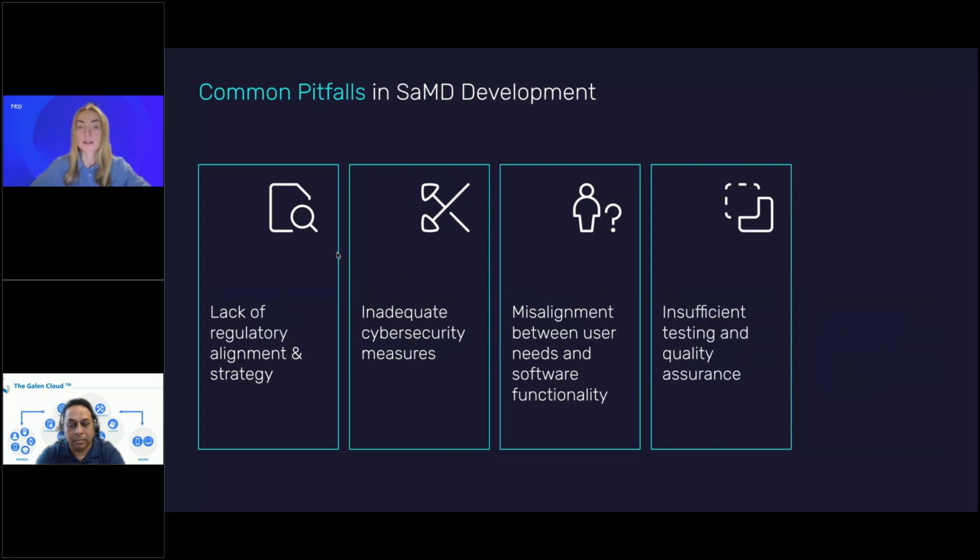Insufficient testing and quality assurance. If we are rushing to get the product to market without proper testing, it's not the best. It can lead to compliance issues, product recalls, or even worse, again, patients at the end. We have to remember that we have to test the app very well to ensure patient safety.